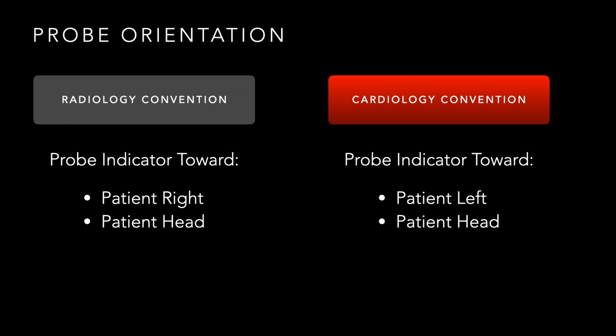We're going to scan from the patient's left, using our left hand as a sonographer to put the probe on the patient's chest, and we're going to use our right hand to do the machine controls. Before we think that it's just some sinister ploy to screw up all the right-handed individuals, it makes sense. If you have to position the patient towards you, it's easier to reach with your left hand to the patient rather than reaching all the way over with your right hand across the patient.